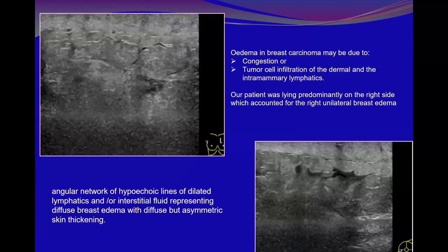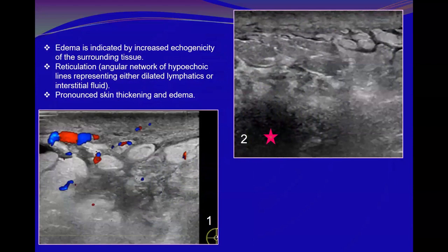One more example: edema in breast cancer in the left breast, looking for the same process. An intermixed patchy area of hyper- and hypoechogenicity due to infiltrating malignancy and adjacent swollen edematous breast, and the network of fluid in the lymphatics and fascial planes, resulting in congestion.